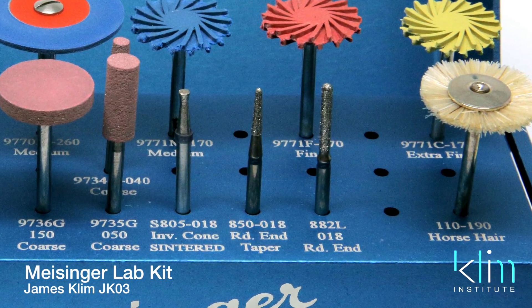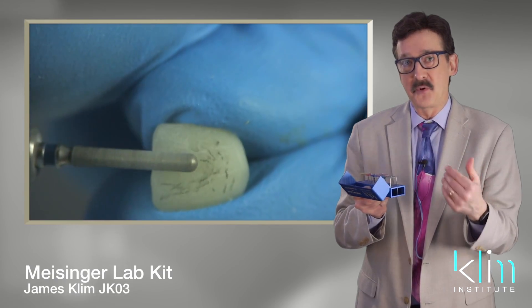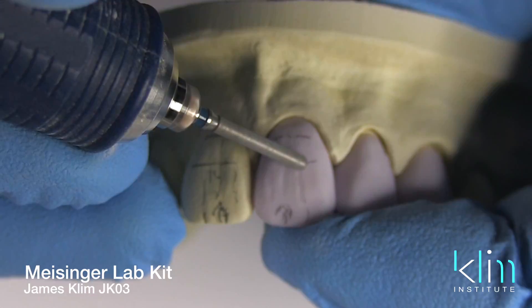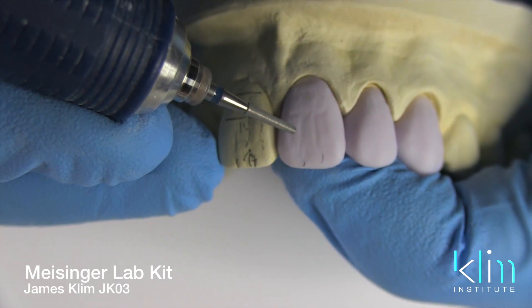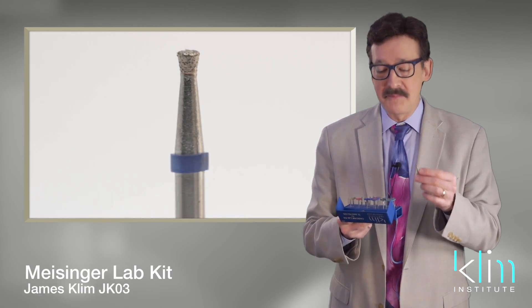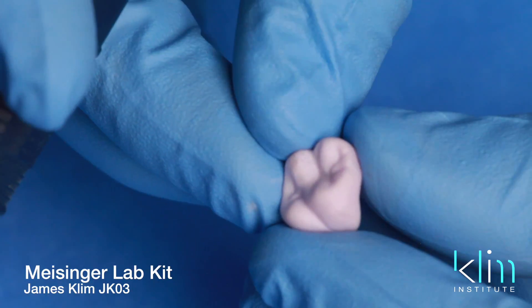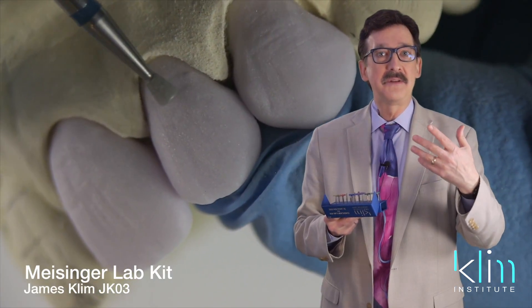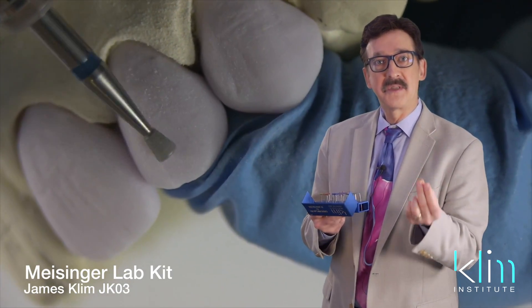There are three basic diamonds on this kit. One is a cylinder — it's the 882 cylinder. It's the larger diamond cylinder with a rounded end. My objective when applying surface texture is to go with the largest burr I can to get the job done. Then we have the 850, which is a little smaller burr for more refined texturing. And we have an inverted centered diamond cone. The diamond burr I use the most is the inverted cone centered diamond — used to refine posterior occlusal anatomy and for microtexturing anterior teeth. The objective is to use the largest burr you can, then work to the smaller burr for a specific purpose of texturing.